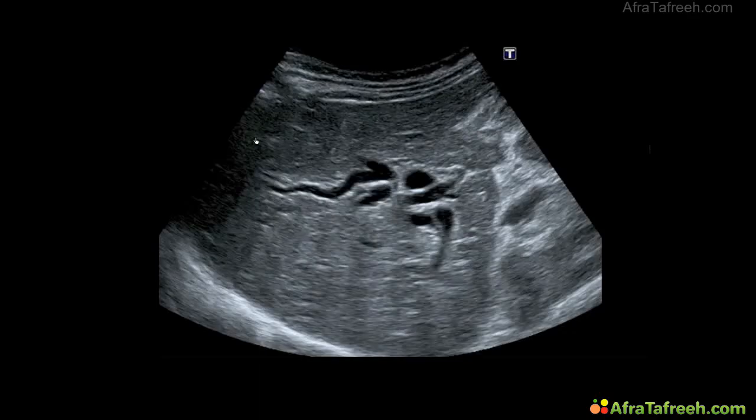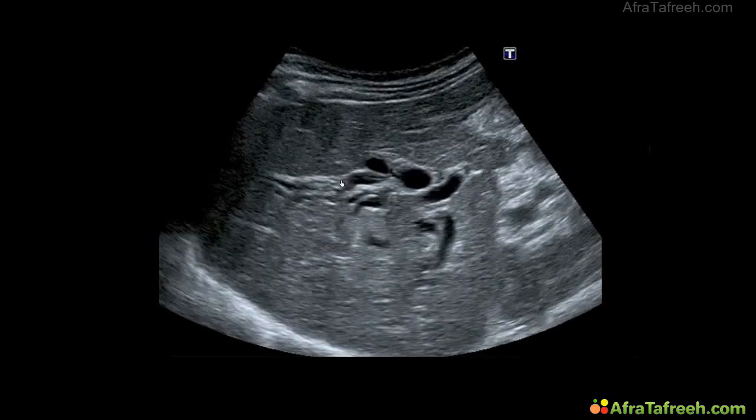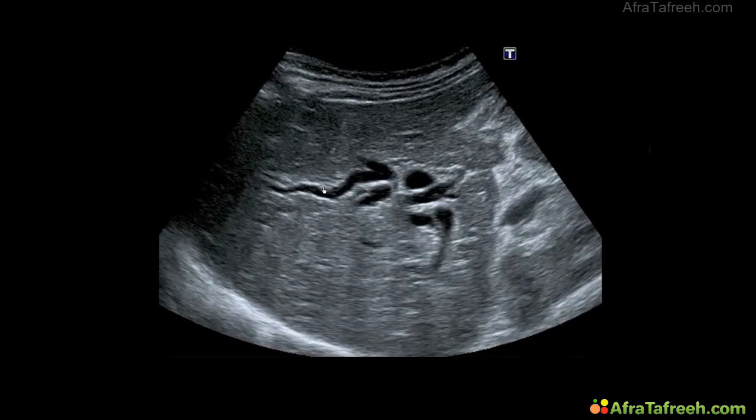Now let's see what's wrong over here. There are more structures than we have seen before. There are bile ducts seen over here. Don't they look like branches of an old tree? I think so. And in the loop, you can clearly see these tubular structures over here following the portal veins.